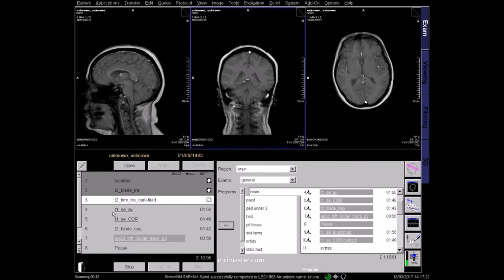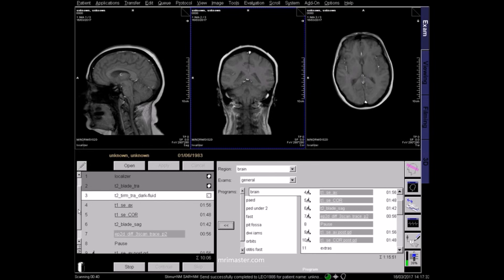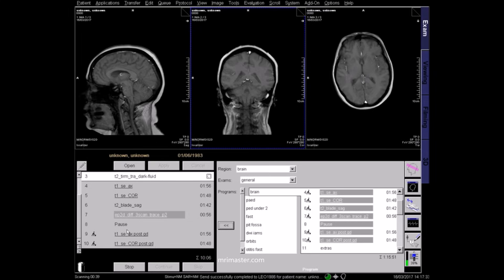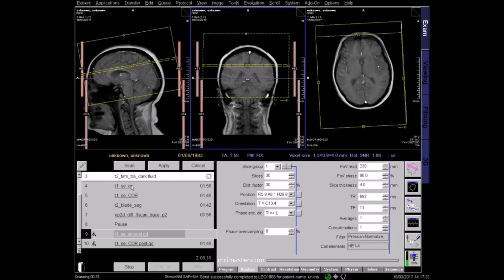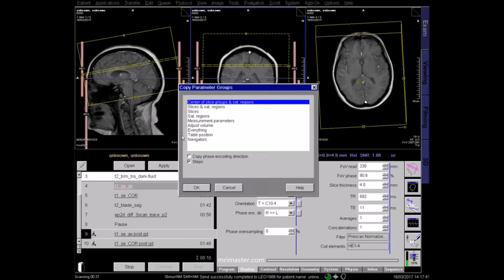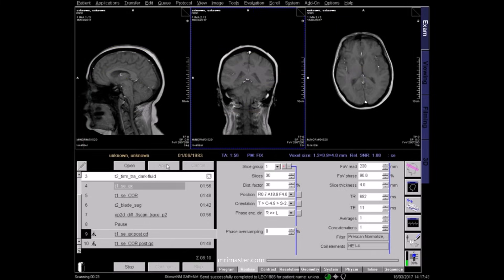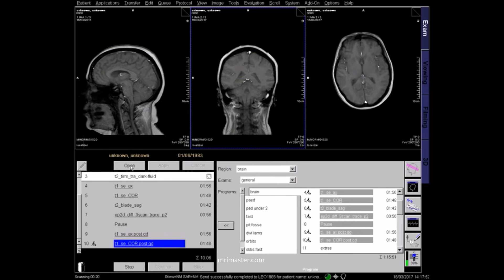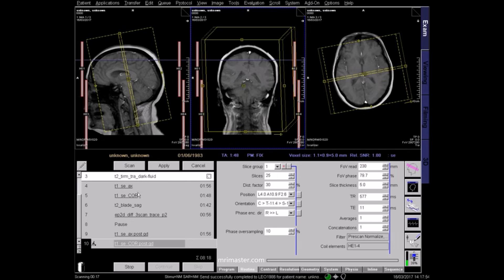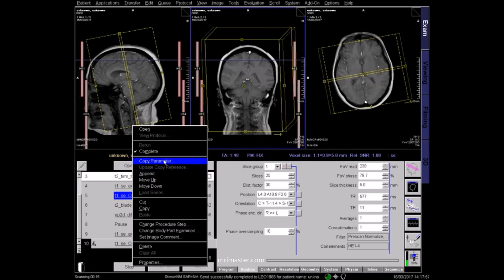If the radiologist has requested a gadolinium injection, it's essential to check the patient's kidney function in line with national and hospital guidelines. Only proceed if it's safe to do so. When planning the post-contrast sequences, axial planning can be copied from the pre-contrast T1 sequence, and the coronal post-contrast sequence can be copied from the pre-contrast T1 coronal.